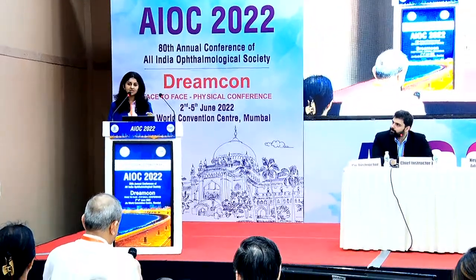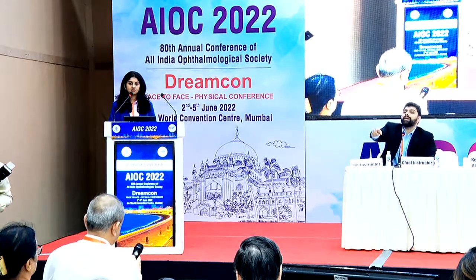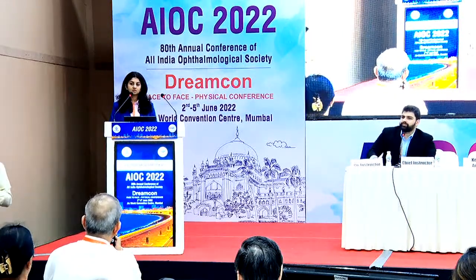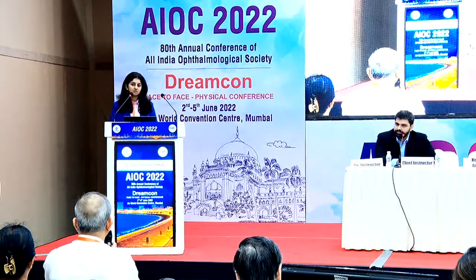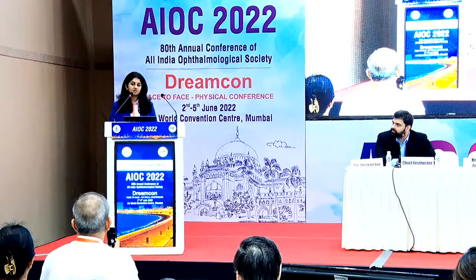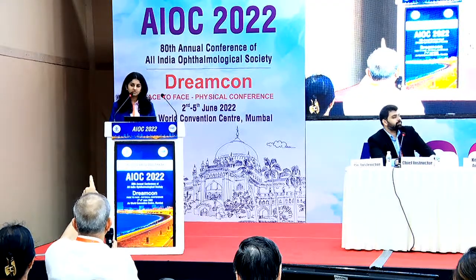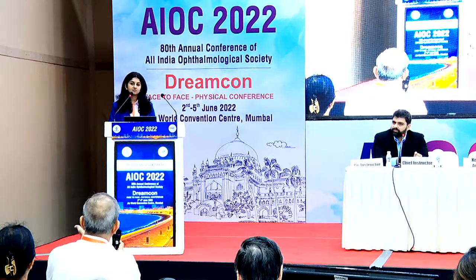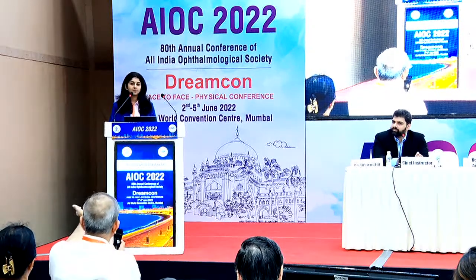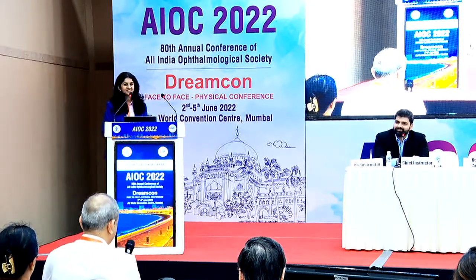It's a single use, disposable. Like we use it one time and we just throw it. But how do you ensure that the first part is also sterile? The gel tube will have a small opening above it, so that has to be opened by the surgeon. These are the small points where you can get infection and can ruin your things. Or you go in for a simple paracaine drop. You can use it for 4 or 5 patients and then throw it off. Wonderful surgery. Thank you.